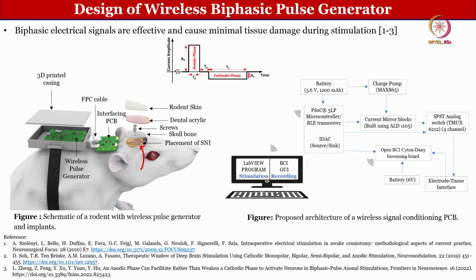Then once everything is ready, now you connect it to the electrode interface board, EIB, then there is an FPC cable. Now from there you will give the connection to electronic systems. Okay. Now this is a wireless pulse generator. In this lecture I think we will not discuss much detail about it, but I just want to give you emphasis of how it looks like.